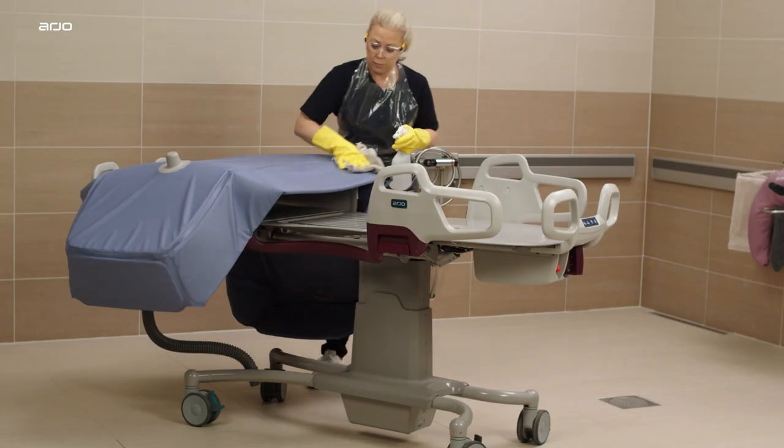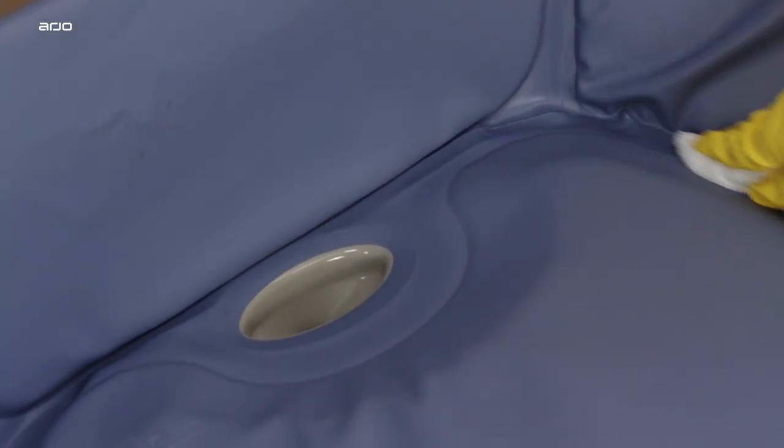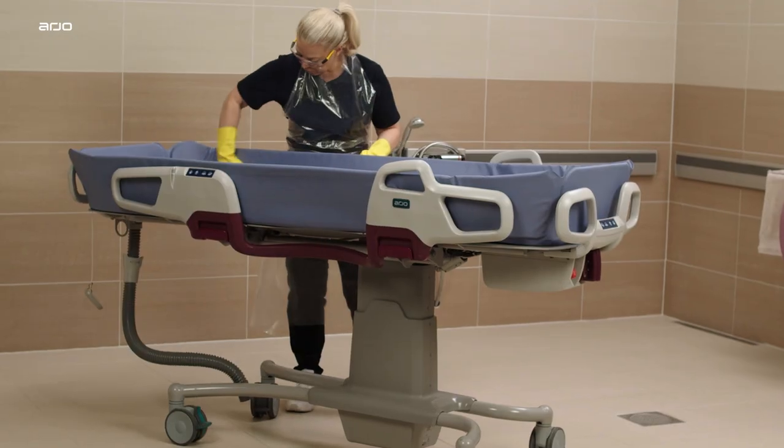To avoid cross-contamination, clean and disinfect the Corivo and all parts after each use, following the instructions for use.